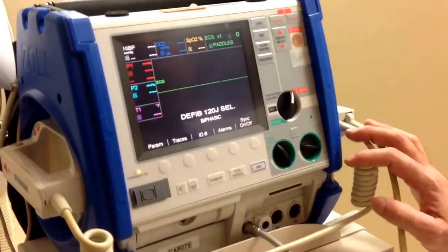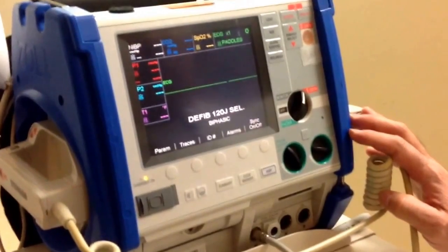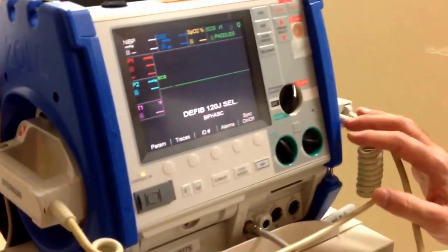This is going to be an instructional video on how to set the time on an M-Series ZO cardiac defibrillator monitor.